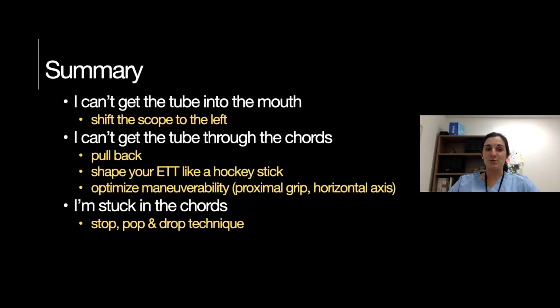And finally, if you're stuck at the cords, don't forget the stop, pop, and drop technique. That's really going to help you getting a successful, easy peasy intubation.